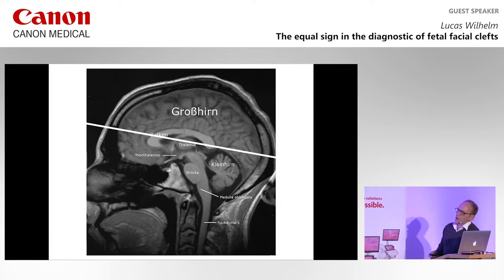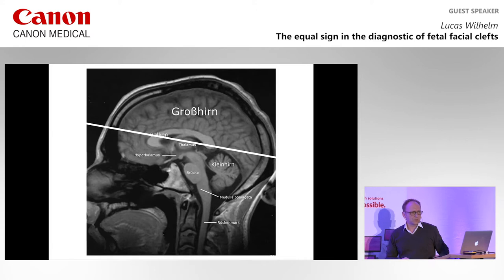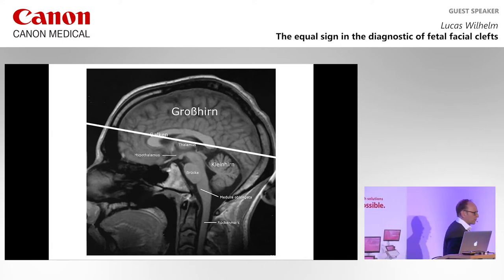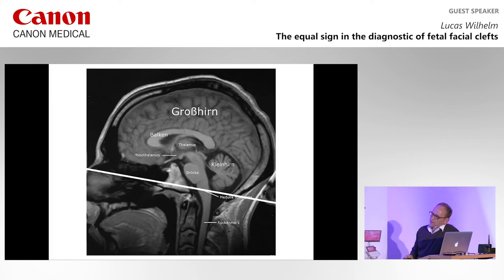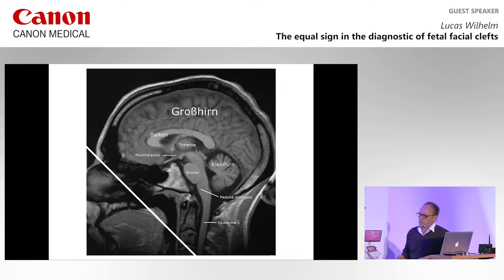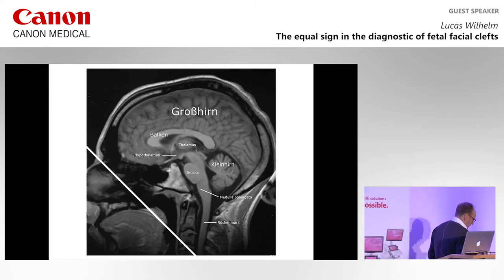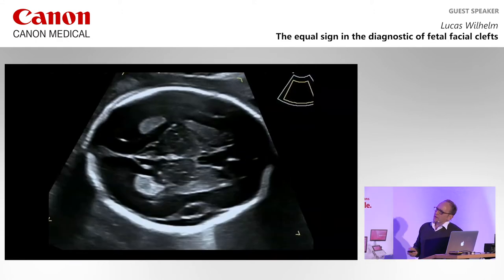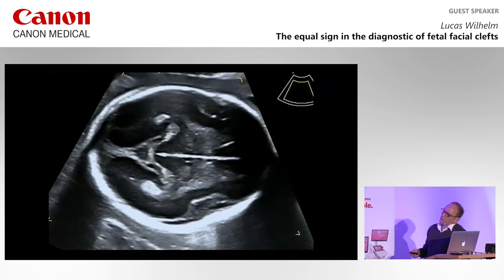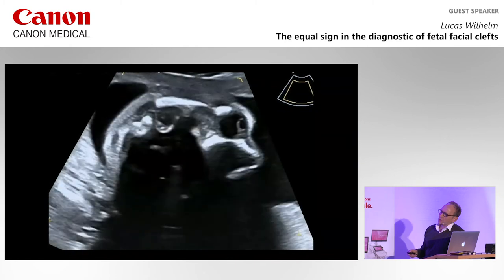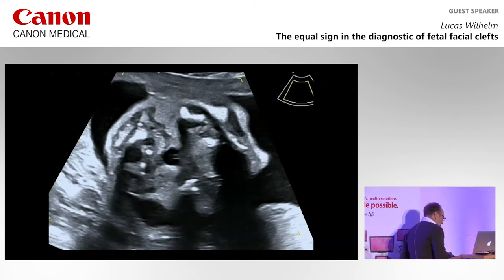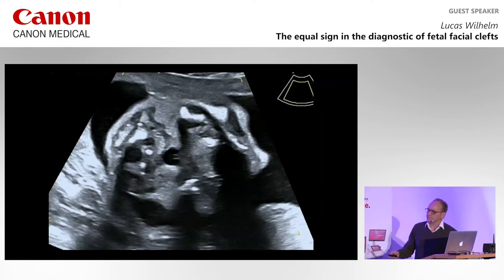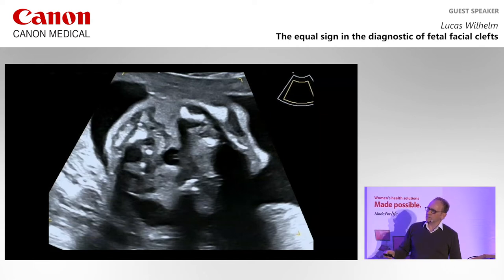The first approach starts with a horizontal plane — the plane you use to measure the head and check brain structures. From this plane you move the transducer parallel in the caudal direction; then the pharynx opens and you come to the soft palate and the uvula. Sometimes you have to move the transducer a little bit to find the uvula. In the ultrasound you move the transducer in the caudal direction, then in the center the pharynx opens and you see this structure. Because of its typical echogenic pattern, we called it the 'equal sign' — because it looks like an equal sign.